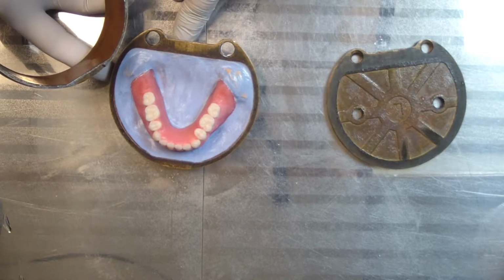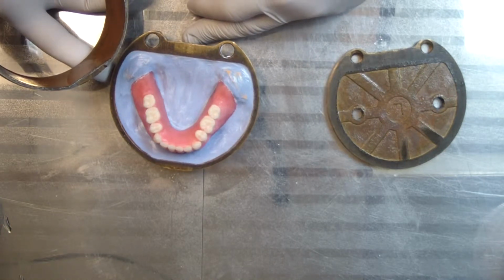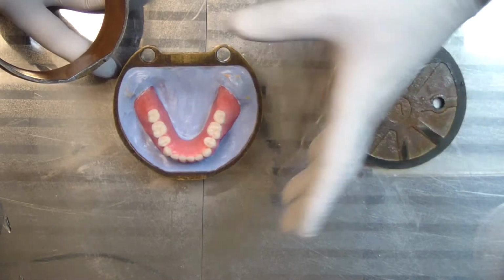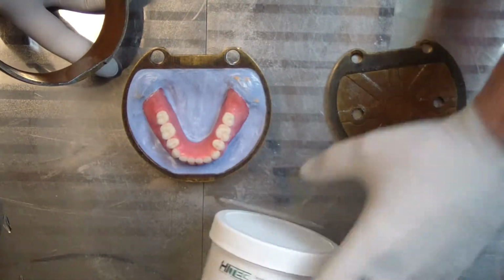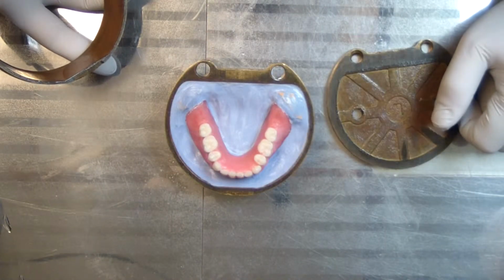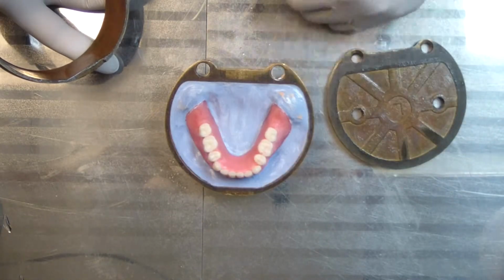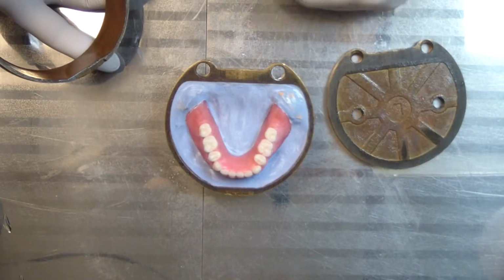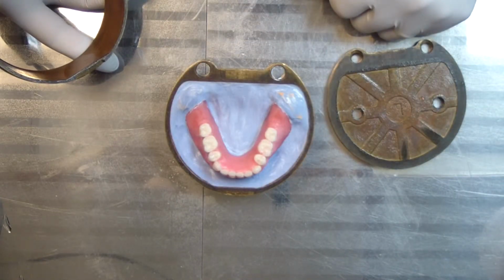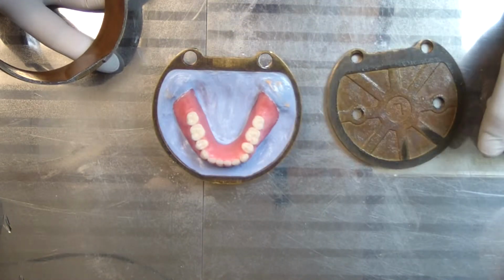What happened here is that the impression was overextended, obviously, like it happens a lot of times. So this is just a regular case. This is not a showpiece. This is just a regular production case that I'm doing. So I had to build it up a little bit over the landing area to kind of block out the remainder of it, just so I have it up to the wax where I need it to be.